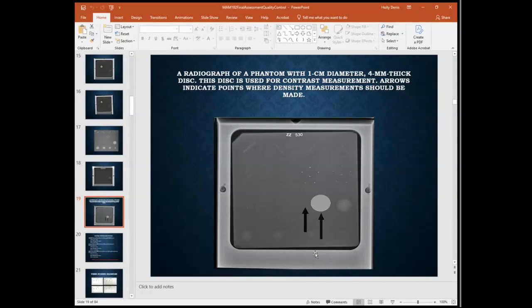And then this is the disc. So we start here with counting. So this is an actual fiber. 1, 2, 3, 4. And I can see this one. I think this one I can see pretty good, and I think it's more than 3/4. So I would go ahead and count that as a full point as well. So 1, 2, 3, 4, 5. So I think everything on here got a perfect score except for these specks, which only got 4 out of 5. Still definitely passing.